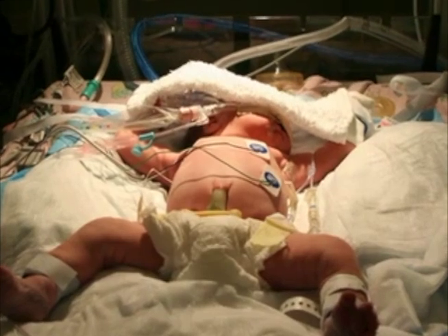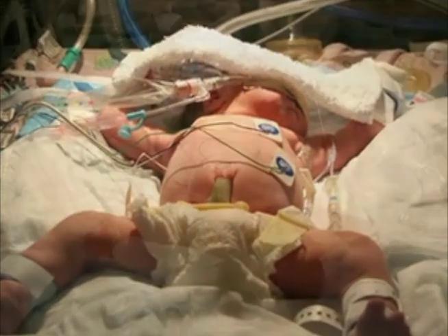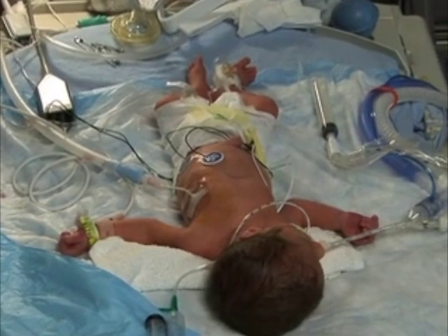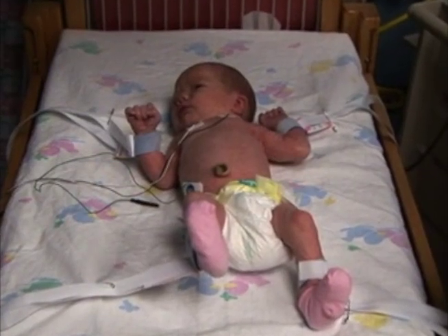Umbilical catheters should be removed when complications occur. The length of time an uncomplicated catheter may remain in place is the subject of some controversy. At present, we recommend strict adherence to individual institutional policies until consensus on this important issue can be obtained.